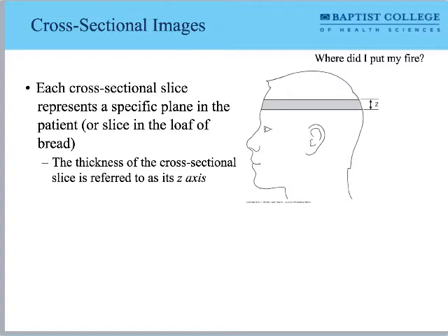So it's not enough just to look slice by slice and say, oh, that's the pancreas, that's the spine. We need to be able to think about how all of that interconnects three-dimensionally. Because this slice-wise way of thinking is three-dimensional. So that's the major transition to go from X-ray, two-dimensional, everything superimposed, to CT three-dimensional. We're adding all this stuff together.